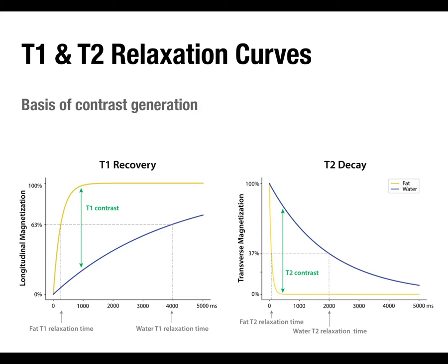As they fall out of phase, some of the protons are going to hit that receiver coil early, some are going to hit it late, and so you're going to get a reduction in the strength of the signal you're seeing in that coil because of that dephasing, and that's going to sort of mush the signal up quite a bit. And so your signal goes down there.